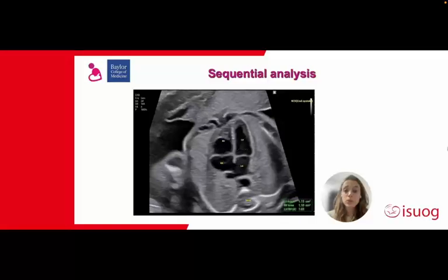We will be able to measure, and we can select what we want to measure, whether it's atrial width or ventricular width, or perhaps the ventricular area, ventricular length, or we can also select to measure all of them in one go. We can also measure the cardiac axis, and I will clean out all those just to show you the cardiac axis in a better way.